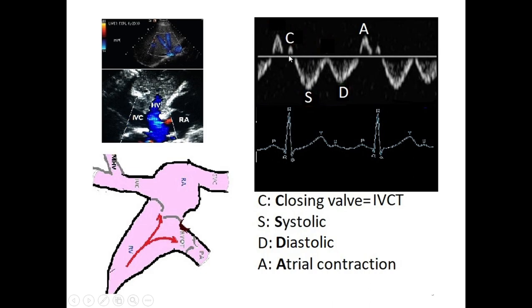Because the probe is positioned superiorly, blood moving toward the transducer produces a positive deflection corresponding with the QRS on EKG. This small positive deflection is called the C wave, corresponding to tricuspid valve closure. At this moment both the tricuspid and pulmonary valves are closed, so it corresponds exactly with the isovolumetric contraction time (IVCT) of the right ventricle.